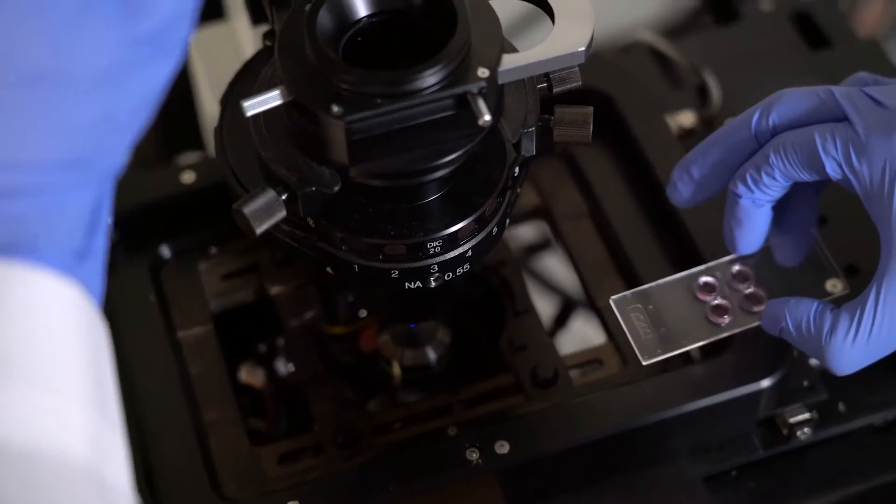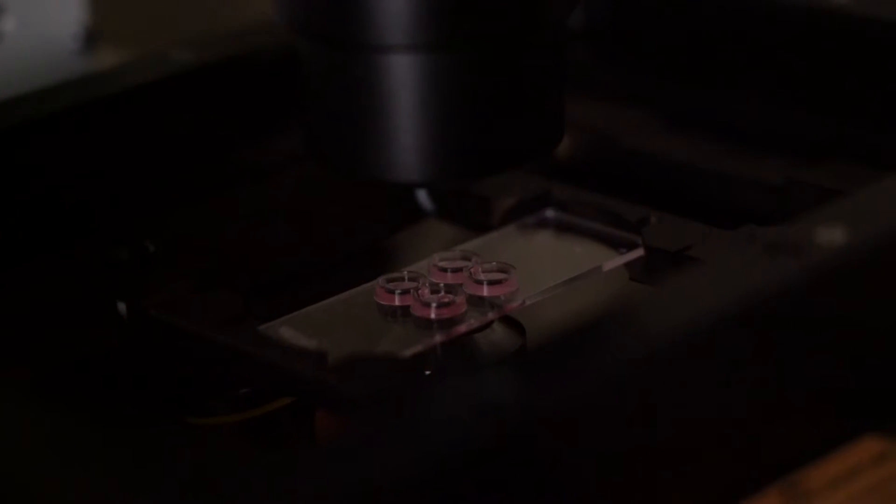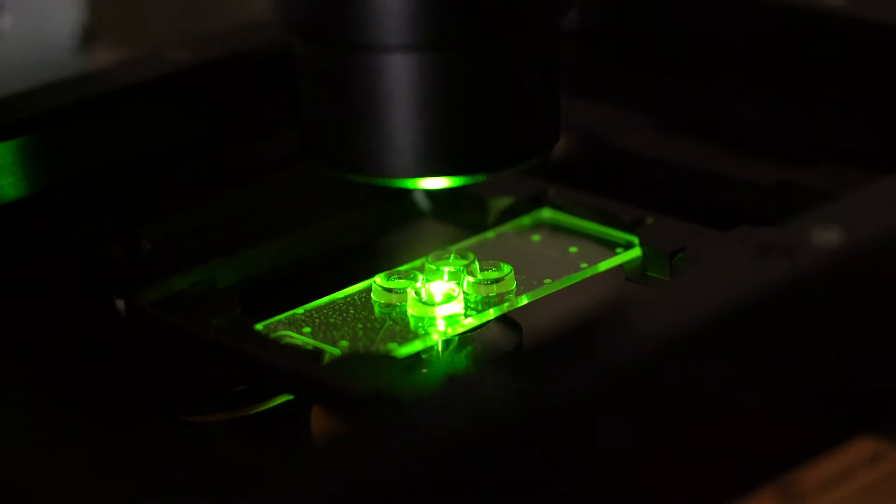In the Zona chip, neurons grow much better for longer periods of time. In particular, for hippocampal neurons, we've found that we can isolate axons for up to three, even four weeks.